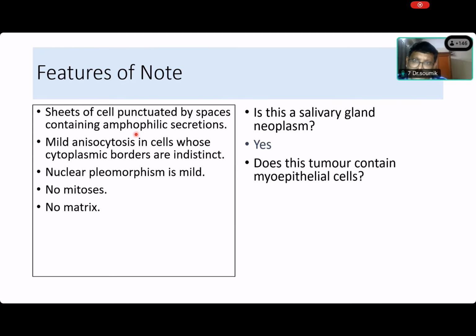Yes, have you seen them so far, Somik? No. We haven't seen any myoepithelial-containing tumors so far today? No. We have seen. Oh, we have seen. Very good. So name them. What have we seen? Pleomorphic adenoma, adenoid cystic carcinoma. Very good. Pleomorphic adenoma. Which other one did we see? Akshara, please help him. Adenoid cystic carcinoma. Yes, very good. So we saw two. So at least tell me what the myoepithelial cells look like in pleomorphic adenoma and adenoid cystic carcinoma.